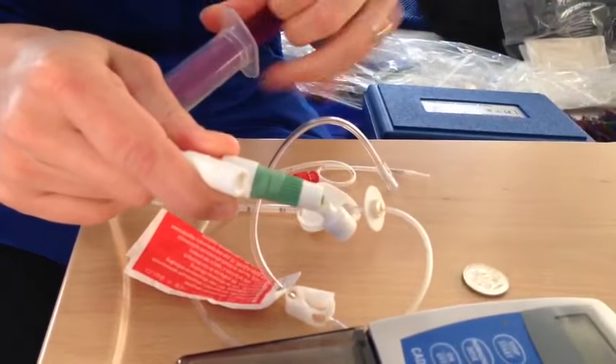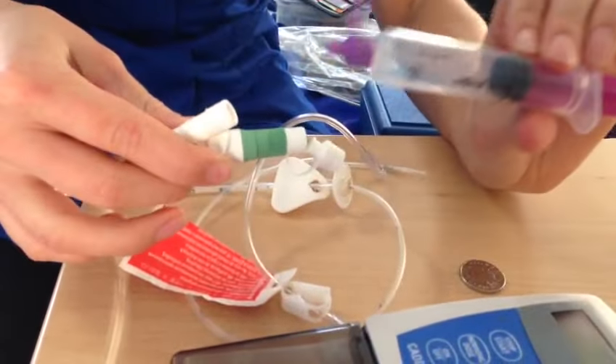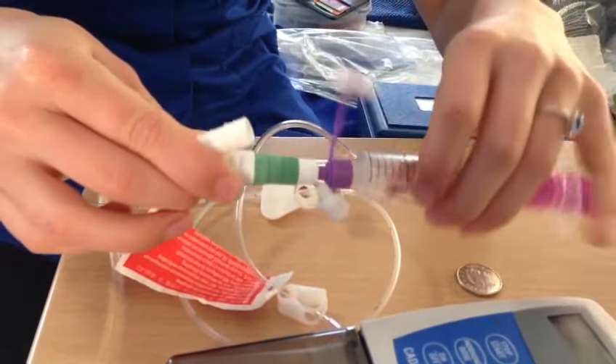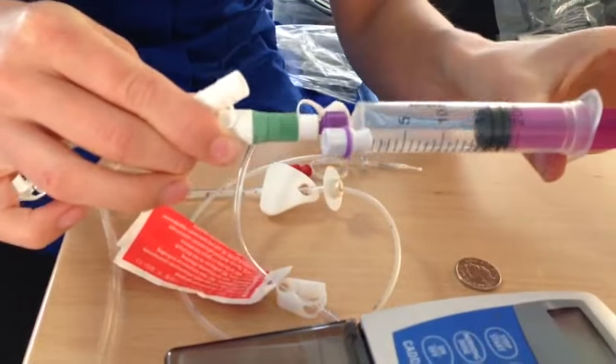Then you need to unscrew the pump from your tube by turning the clear plastic part, and then flush the tube with two syringes of cooled boiled water, which just screws into the end — then you push it through.